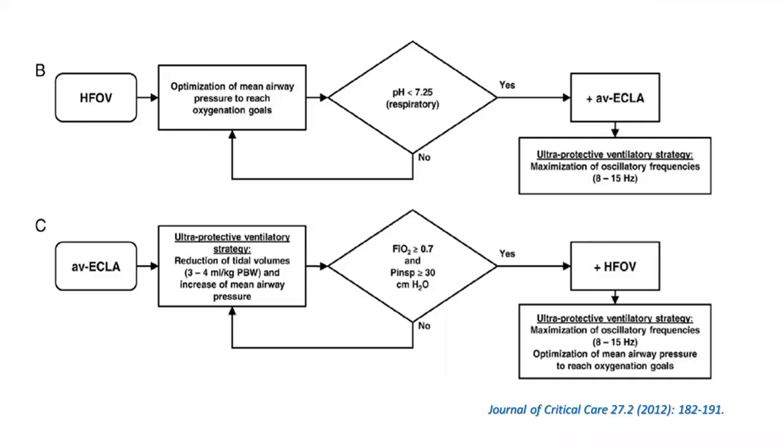Thank you for your nice presentations and topics in the cardiac ICU, the high frequency. Just a small comment about ECMO and high frequency. I use it when I need to quickly recruit the lungs for weaning from ECMO. I used it for a patient with aortic stenosis, and we put him on VA ECMO, then ballooned it. The patient's lungs were white, and we used it to quickly recruit the lungs and wean him quickly from VA ECMO.